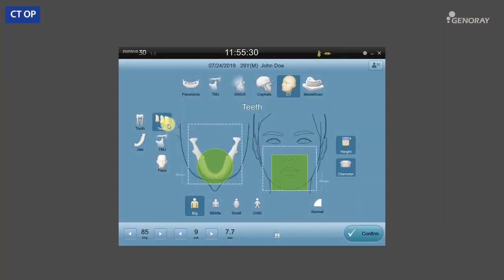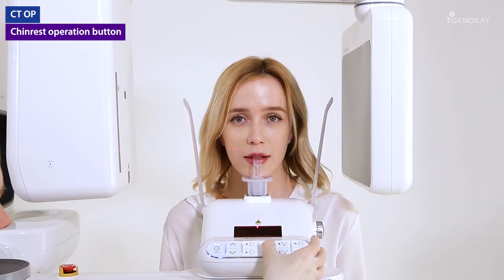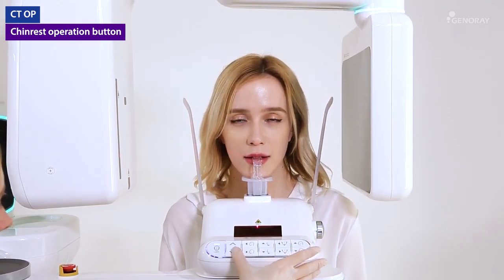Next is the CT mode. CT mode allows you to scan multi-size FOV depending on your need. After selecting the desired exposure mode, click and position the green box in the desired scanning area and follow the instructions on the next page. Confirm that the laser positioning is correct according to the instructions on the screen.